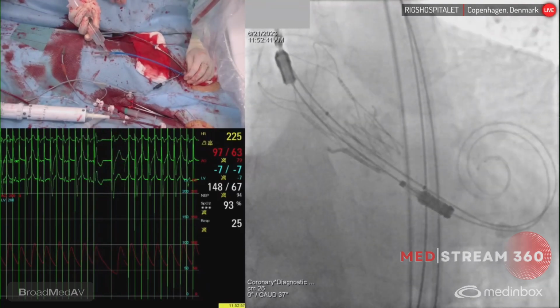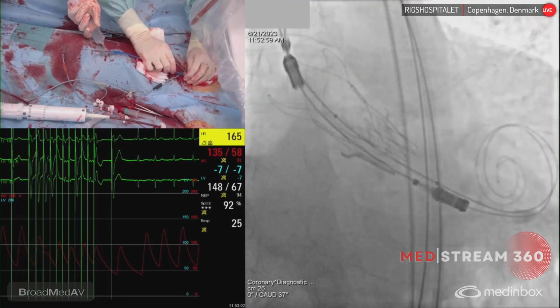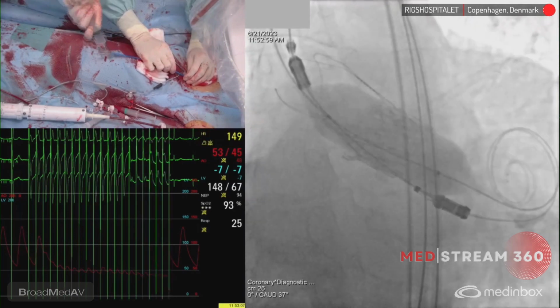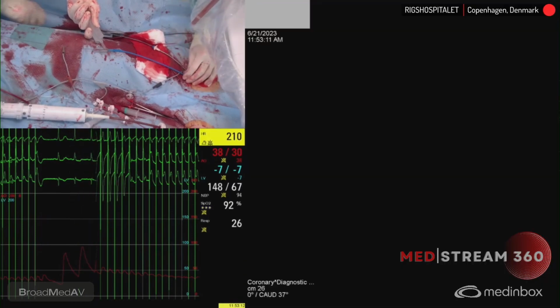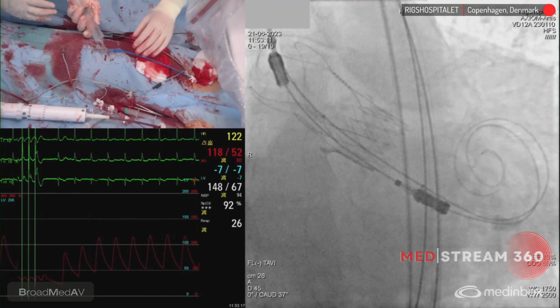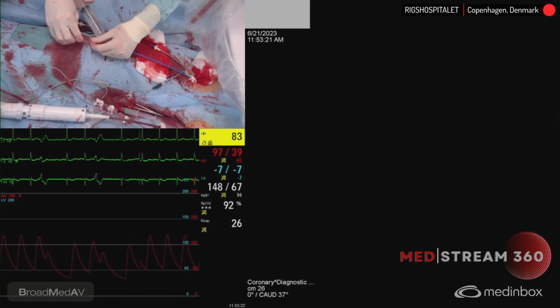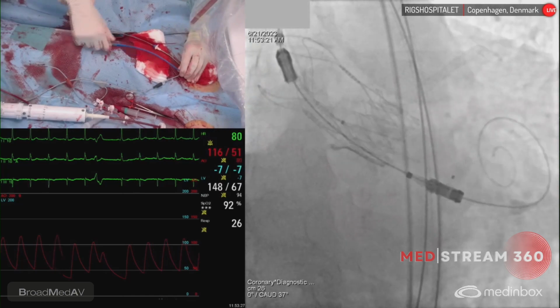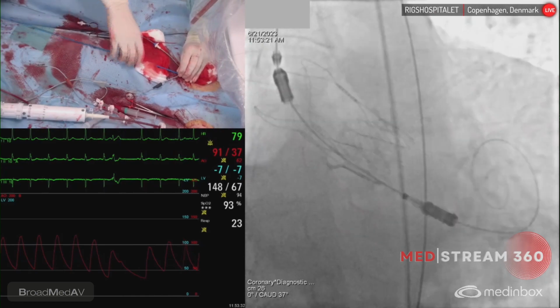Stop pacing for now. Maybe try 200. 200 pacing on. Be ready. Okay. Quick up. And down. Stop pacing. It's good. Okay, now we can still, it's good. Everything is fine. I think this, we do not need anymore. Everybody agrees? This balloon, we can pull out. So this, we get rid of. And now we just do the classical way, okay? Everything out here.